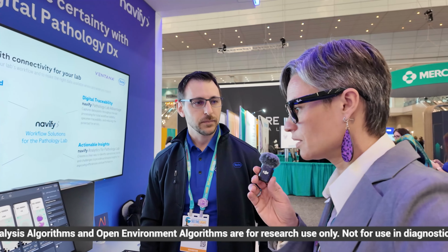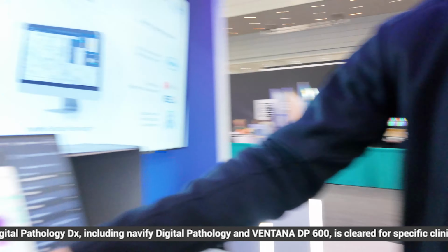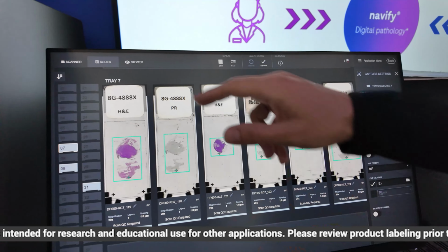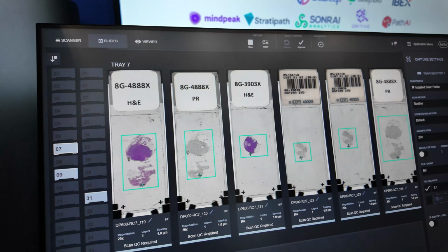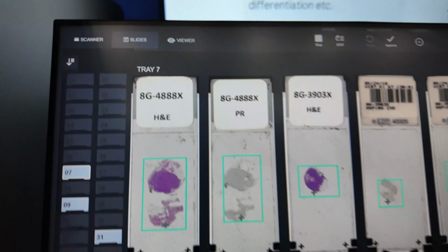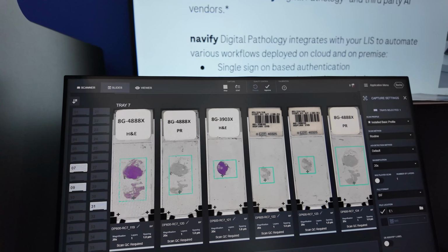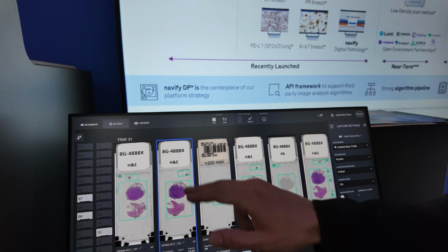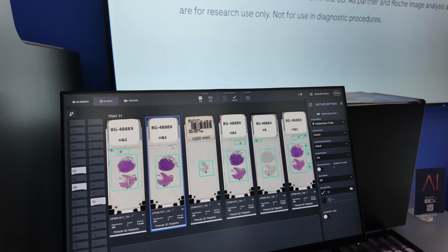Yeah. Exactly. So right now I picked all the regions of interest, and at this point I would say, well, if I like it, just hit approve. So region of interest, meaning it is doing like an automated tissue detection. That is correct. And this is what's gonna be scanned, right? So if you have some dirt particles that were in the field of view or in the region of interest, you can deselect them, right? Exactly. So for example, here it's picking up some other things. It's a touchscreen, and you can just delete that if you wanted to.